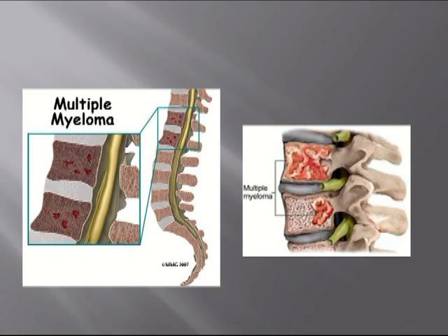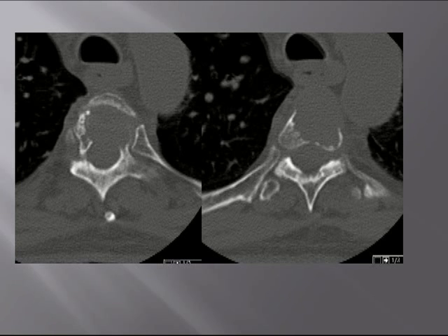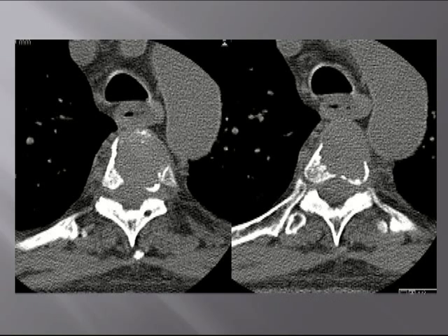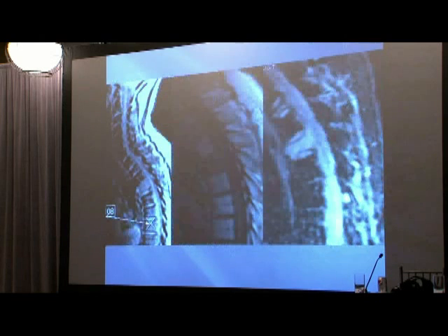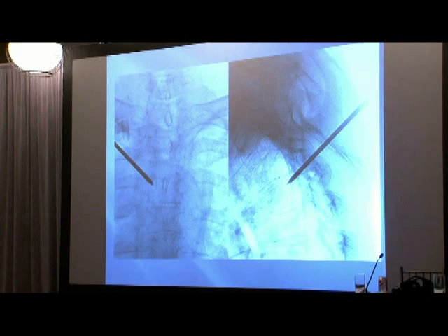Here's a T4 case. There is almost no anterior wall, very expansile, slightly pushing on the esophagus, and the lateral wall is also missing. Partial posterior wall is also gone. Here are different pictures of it. In the CT scan, you can see the extent of the disease. In the MR as well, hyperintensity.